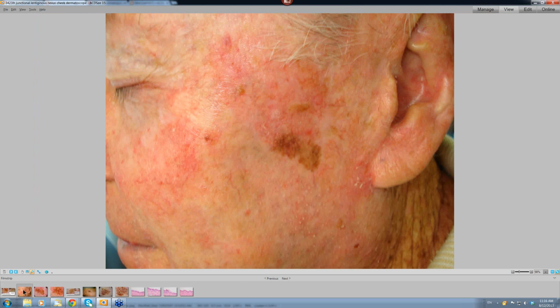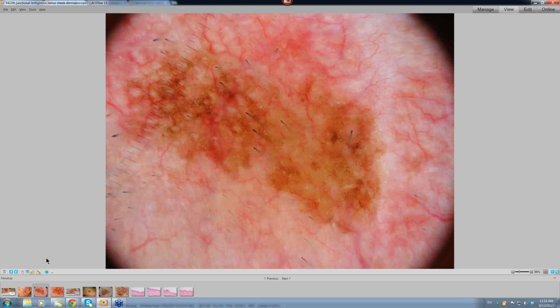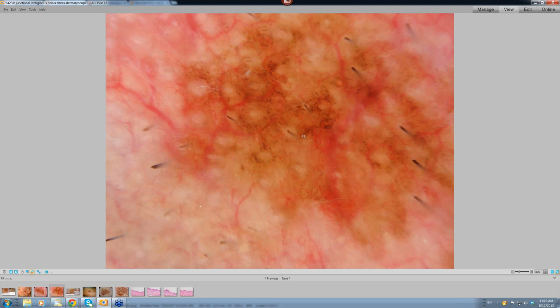Let's have a look at another case. Here's a man with an area of pigmentation on his face. Now again, there's a bit of variation in this pigmentation, and that should attract your attention to it straight away. It's unlikely to be a solar lentigo in those circumstances. Now, you're looking again at this area here. Again, some scattered grey and brown dots round about the openings of the hair follicles. A suggestion of a network in this area back here, but of course you can get networks in solar lentigos as well. And if we go up a little bit higher power, again, you can see these grey dots, probably some brown ones, around the openings of the hair follicles.